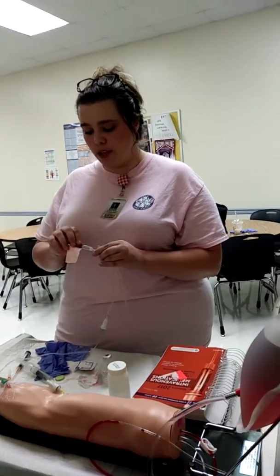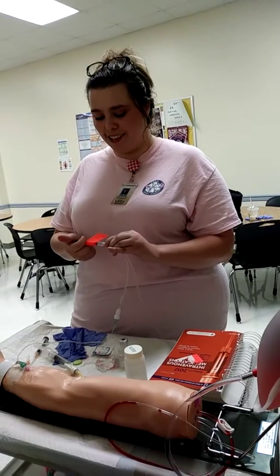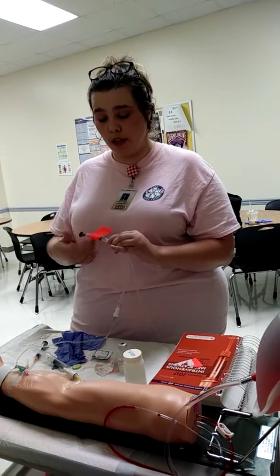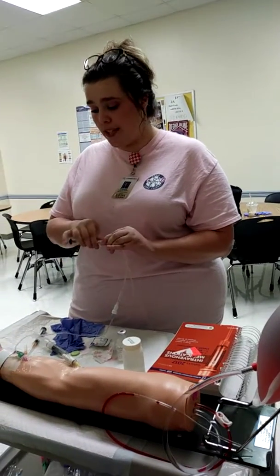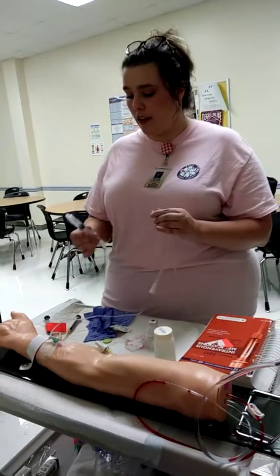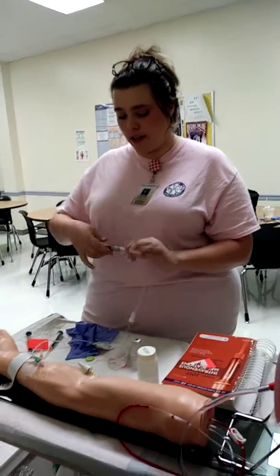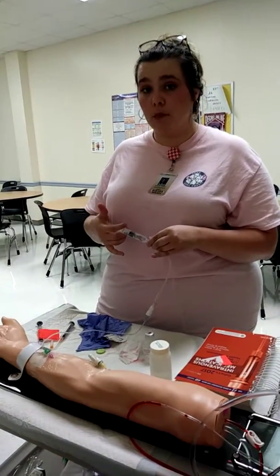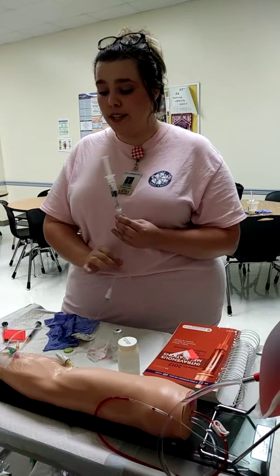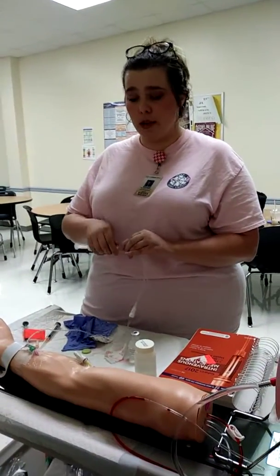And I will get the medication. And I'll connect it, and I'll make sure I push over the period of 2 minutes. Now, once that is completed, I'll clean it off once more. I'm going to get another flush and connect it. And I'm going to flush it again to make sure every ounce of it is flushed through. Then, once that flush is completed, the medication should be moved through the pause-stop method.